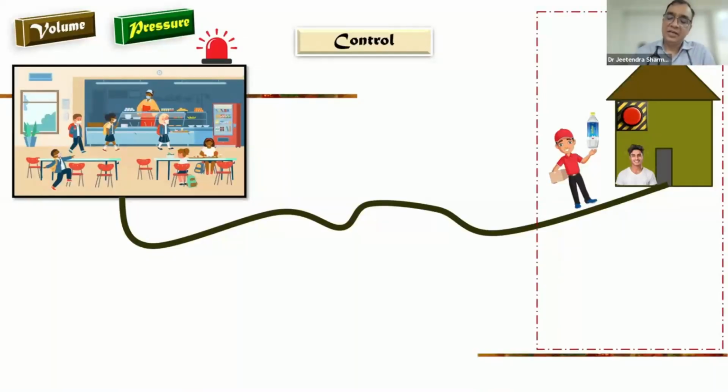This is called assist control. And suppose you don't press any button, then anyway 3 will come. So what is the triggering here? Time is the triggering, because 3 bottles anyway come at 6 a.m., 2 p.m., 10 p.m. But patient triggering is also there, because now you participate outside of your pre-agreement. Whenever you push the button, it will come every time. This is called assist control. Again, when the nature of the breath is volume preset, it will be volume assist control.